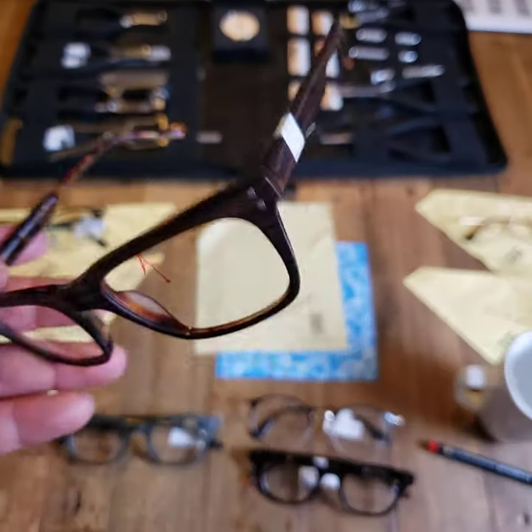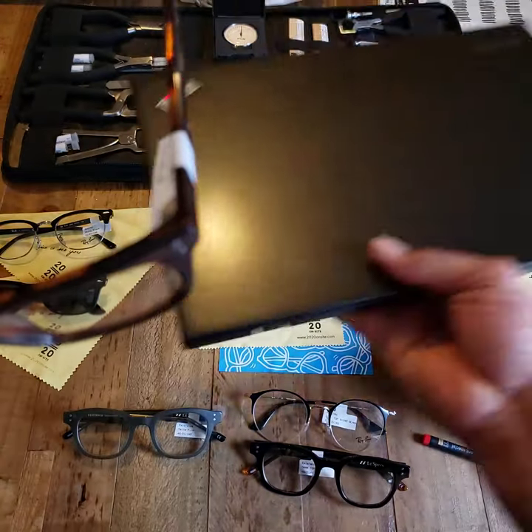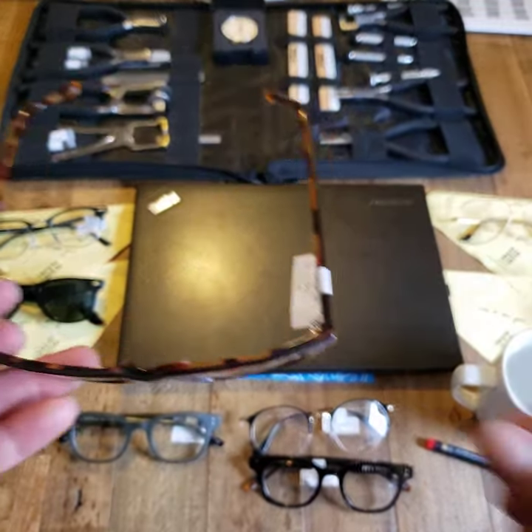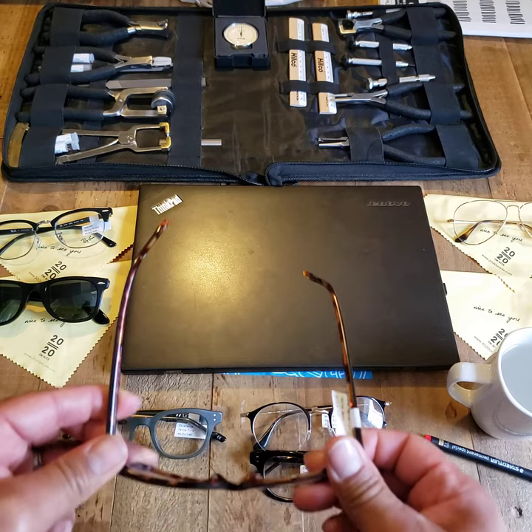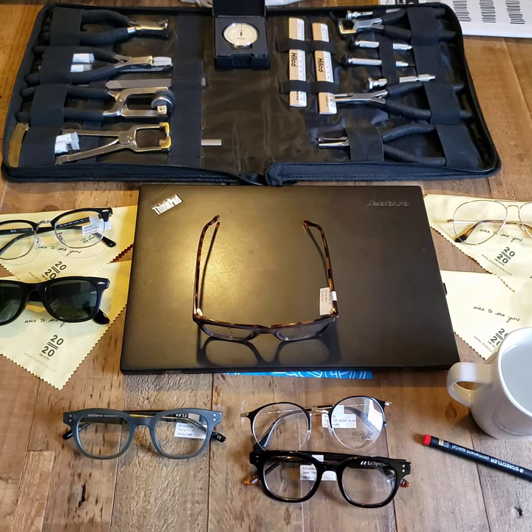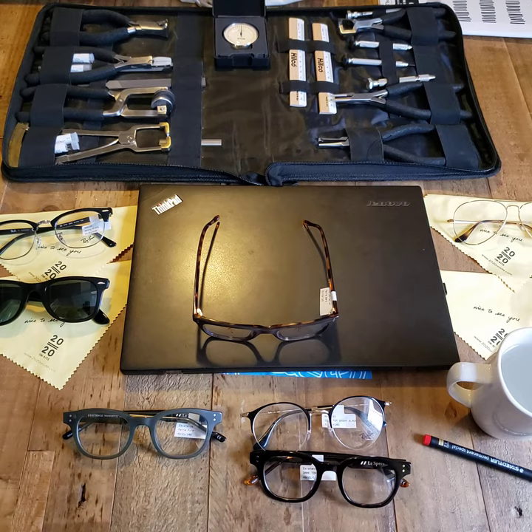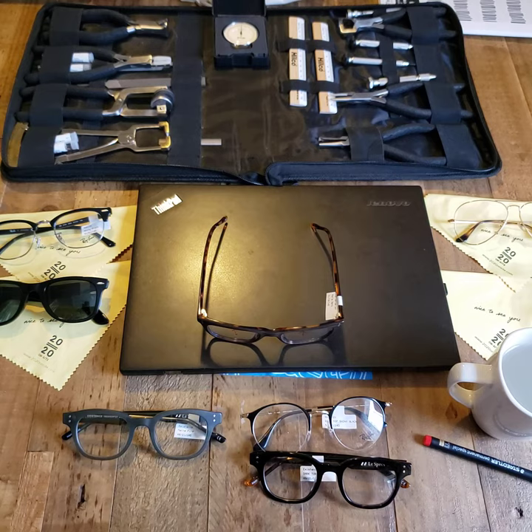Another gauge to keep in mind: when your glasses are on the table — I'm going to use my laptop as a flat surface here, because our table is not very flat — there will be times you put your frame down and notice the frame is not flat on the table. That is okay, because our faces are not completely symmetrical or completely flat.